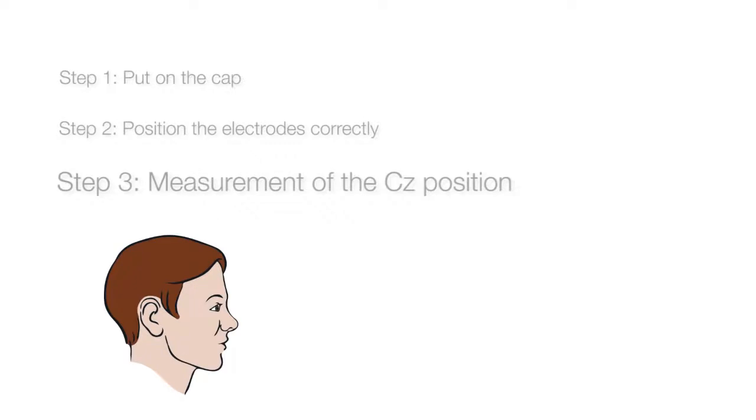The frontal electrodes FP1, FPZ, and FP2 should be positioned at 10% of the nasion-inion distance above the nasion point.